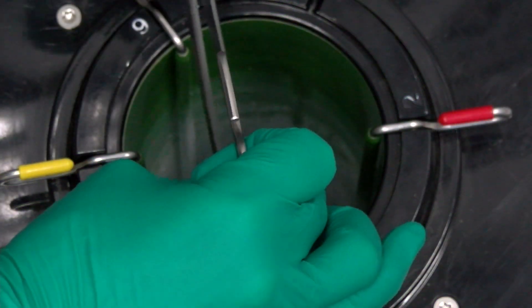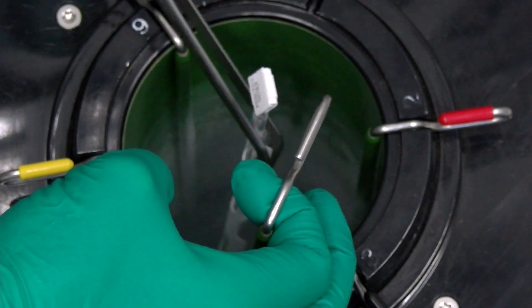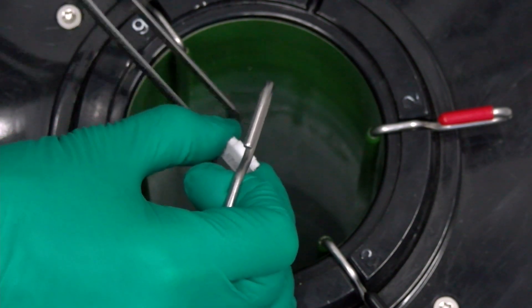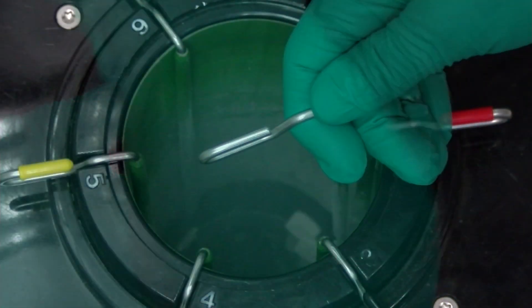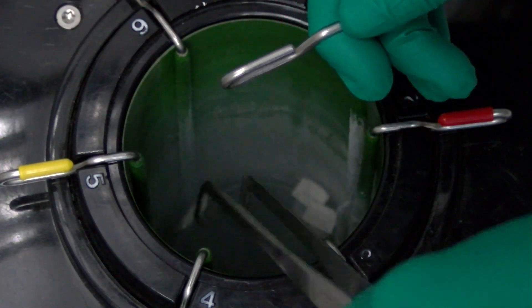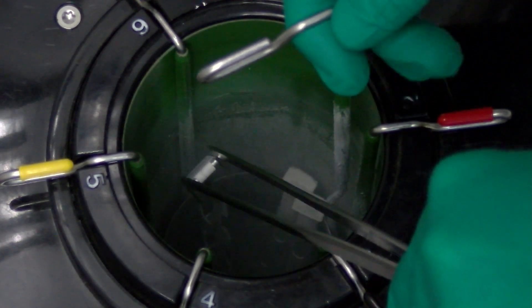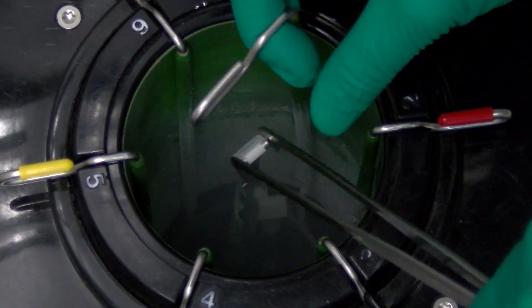After identifying the cane you want to remove the semen from, straighten the identification tab if this has not already been done. This allows easier access to the semen straws in the goblet. Raise the desired cane while lowering the canister slightly. Lowering the canister places the rest of the semen lower in the tank, which is colder.